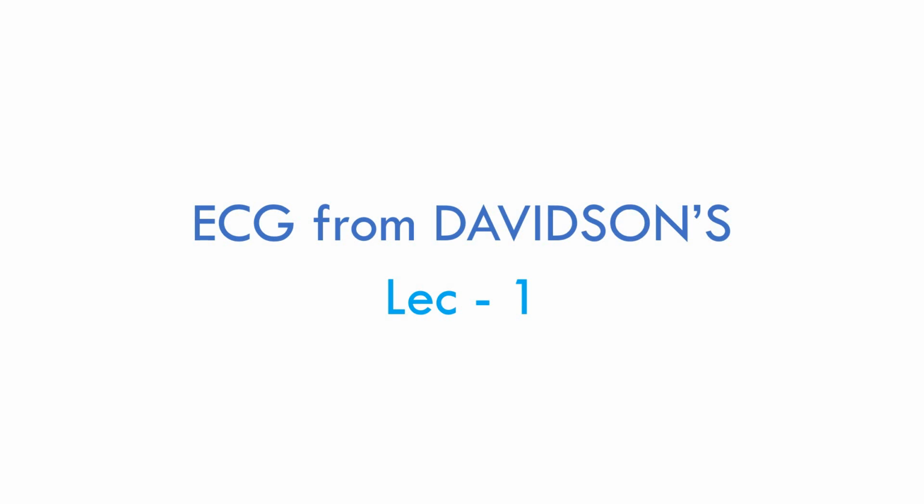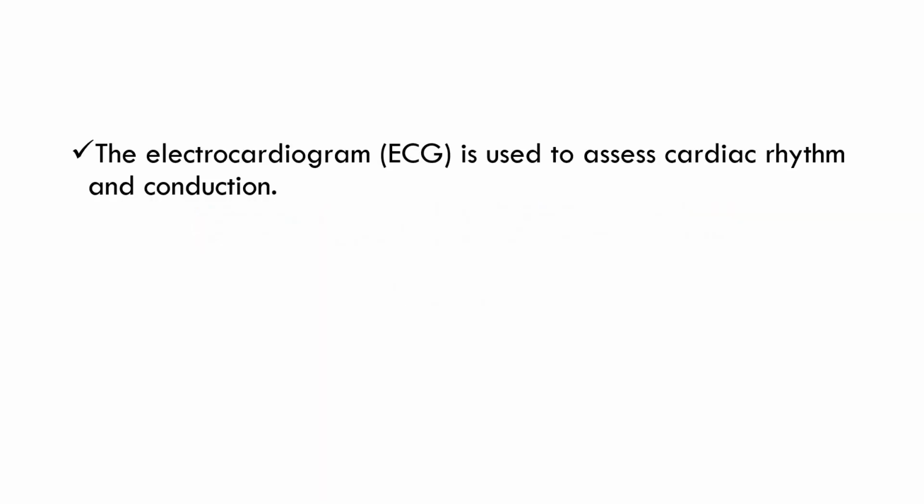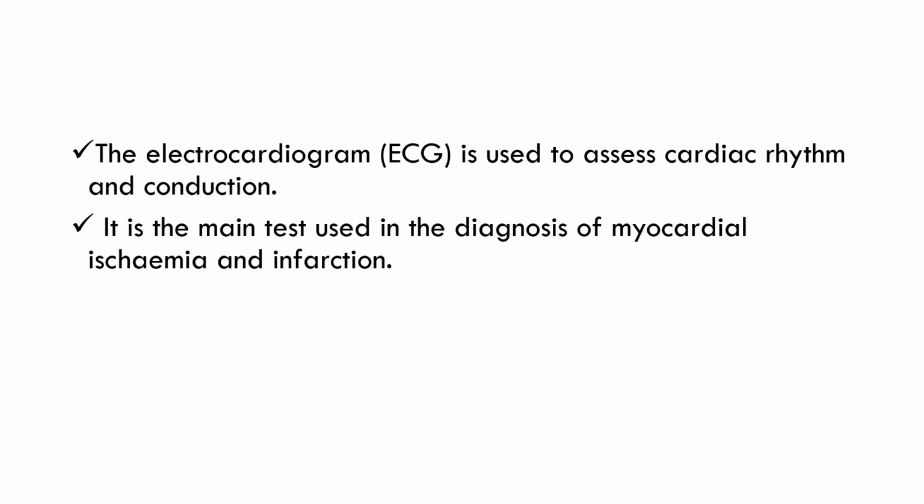Let's start about ECG from Davidson's. The electrocardiogram is used to assess cardiac rhythm and conduction. It is the main test used in the diagnosis of myocardial ischemia and infarction.